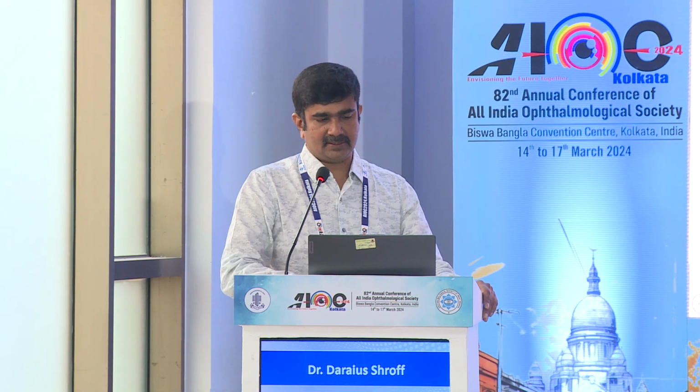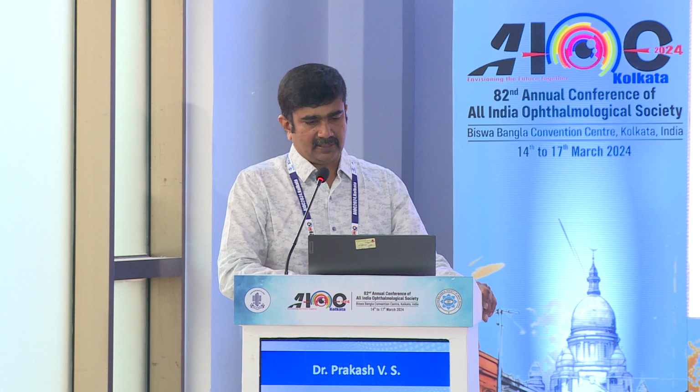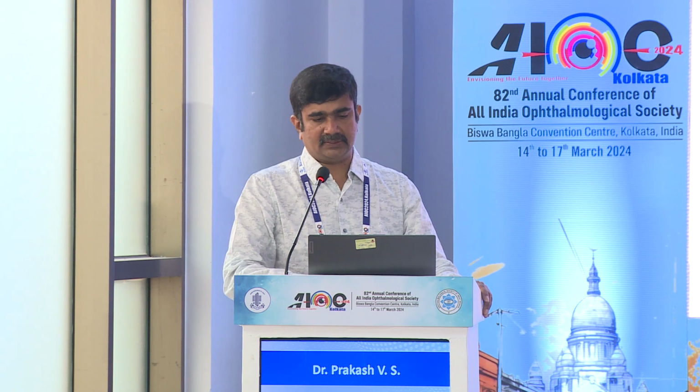This was a 17-year-old boy who is on danazol for aplastic anemia. He came with diminution of vision in his left eye. This is his right eye, which is perfectly normal. And if you look at the left eye, you can see that there is some kind of granular material between the disc and macula with hemorrhages along the edge of the lesion.